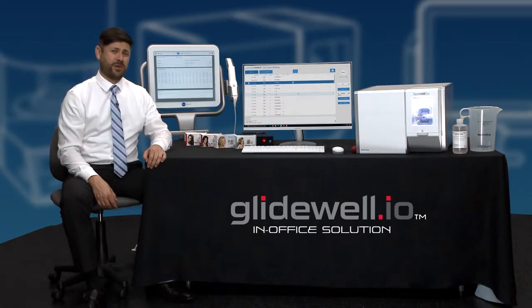Today we'll familiarize ourselves with the features and benefits of the FastMill.io chairside milling system. We'll be looking at the FastDesign.io system workflow, the mill control panel, the FastMill.io chairside mill connections, and the materials used in the FastMill.io chairside milling system.